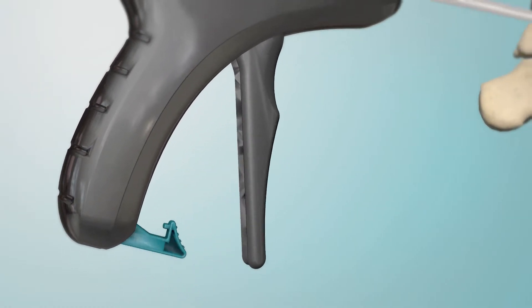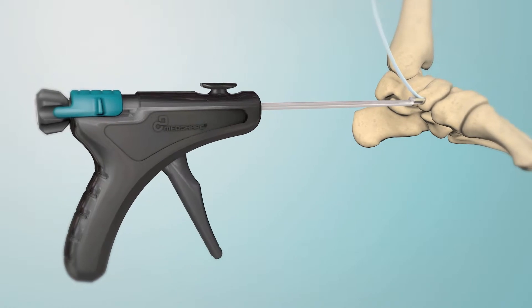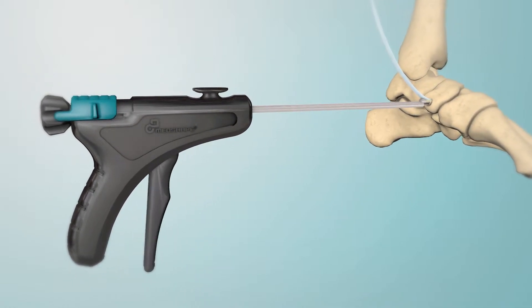Unlock and squeeze the trigger for easy, controlled expansion of the sheath and complete circumferential soft tissue compression.